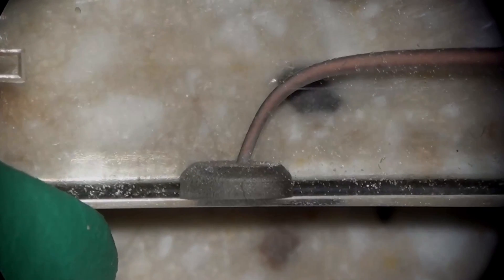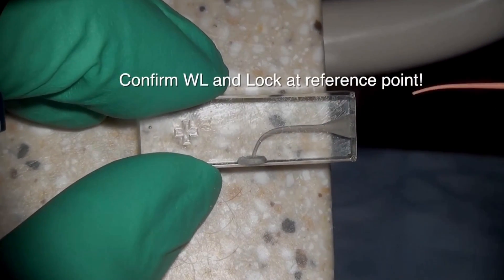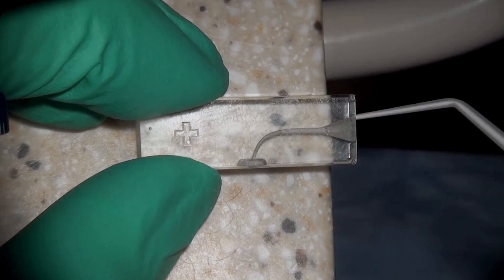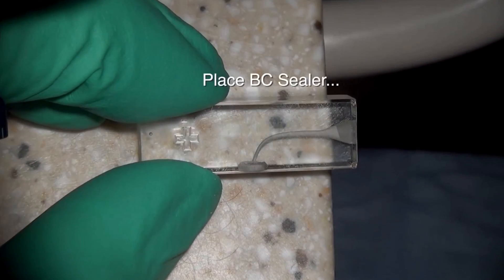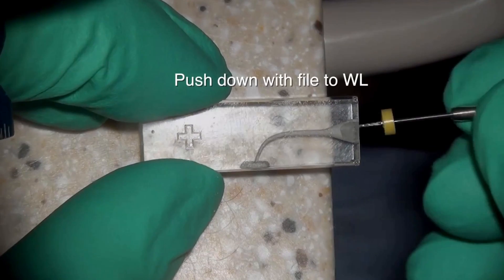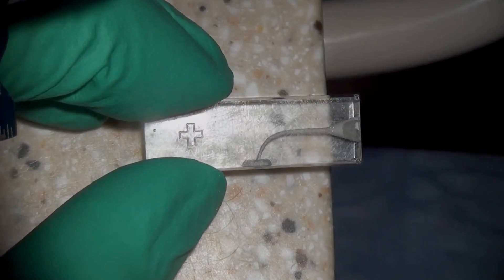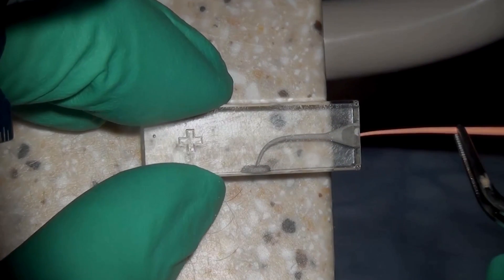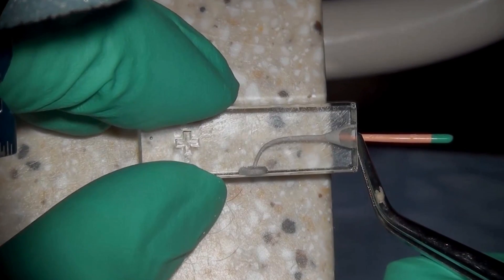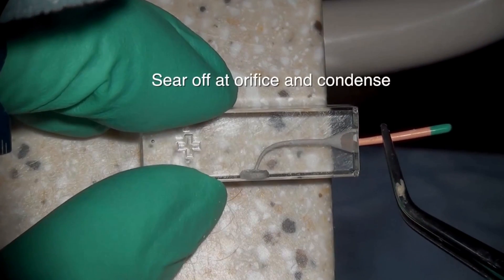Once the 35-04 reached the apex, the 35 ESX gutta-percha cone also reached the apex very predictably down to the full working length. We confirmed it fit all the way to full working length, used the locking plier to lock it in place, placed the bioceramic sealer and pushed it down with a file to the full apex, then seated the cone — making sure the locked area reached the reference point, confirming the cone is fully seated.